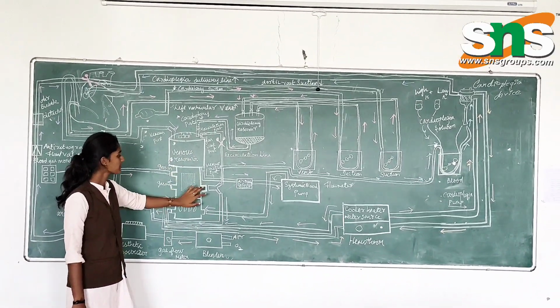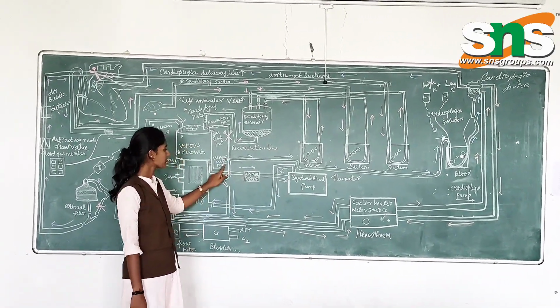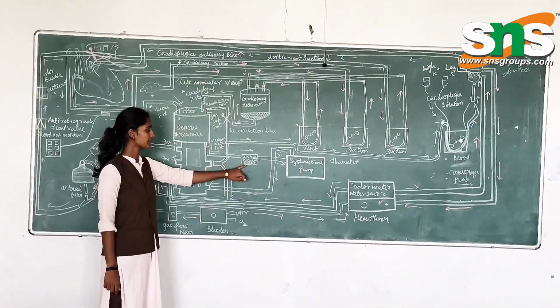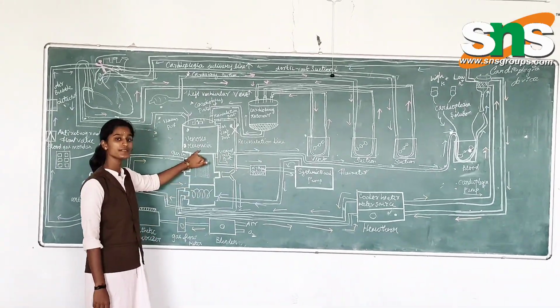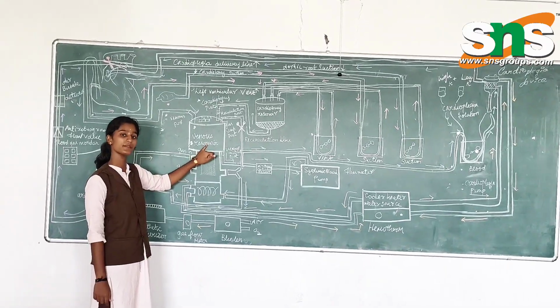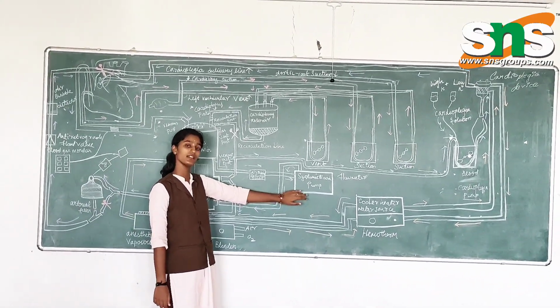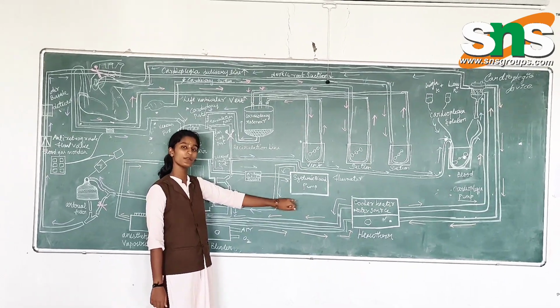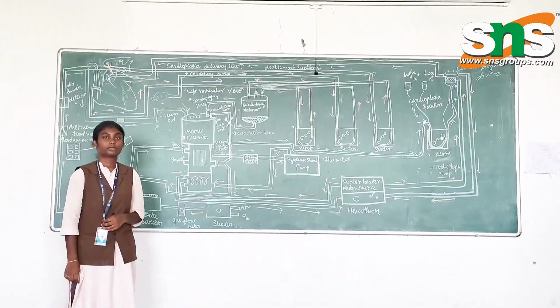Venous reservoir blood travels to the systemic pump with the help of the venous outlet port. A detector sensor removes the air in the blood. The venous reservoir is made up of polycarbonate, and it has 2 filters, a depth filter and a screen filter. For the systemic pump, they use several pumps, the centrifugal pump and the roller pump. Blood travels through the heat exchanger.